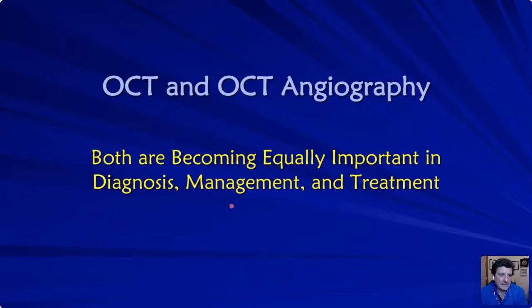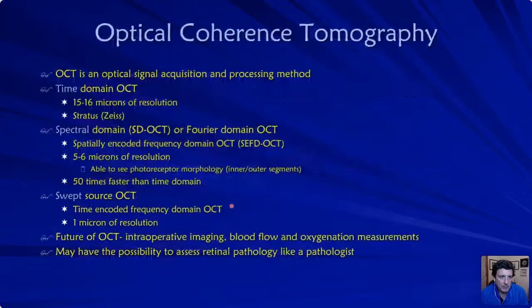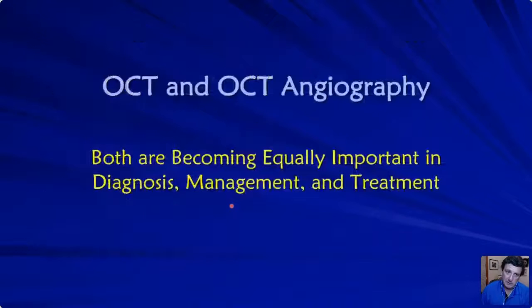So with that being said, OCT and OCT angiography are both becoming equally important in diagnosis, management, and treatment. And that has led me to my next polling. I thought the polling question was coming up here. Sorry, it's coming up, Joe.